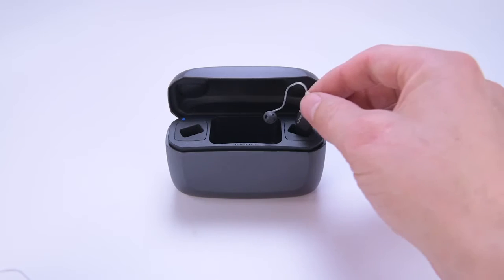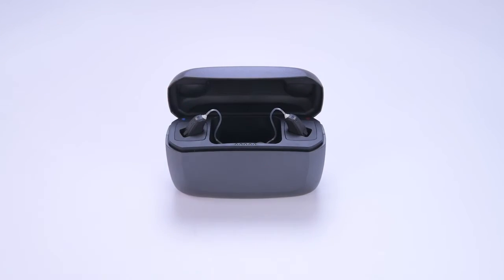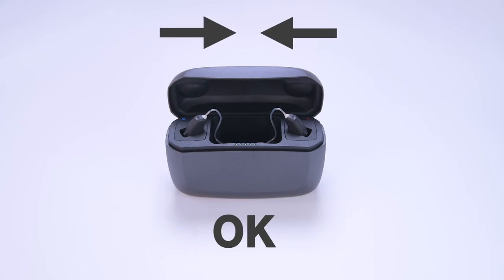Place your hearing aids in the hearing aid charger bays. Ensure that the receivers are pointed inwards and rest in the receiver bay.